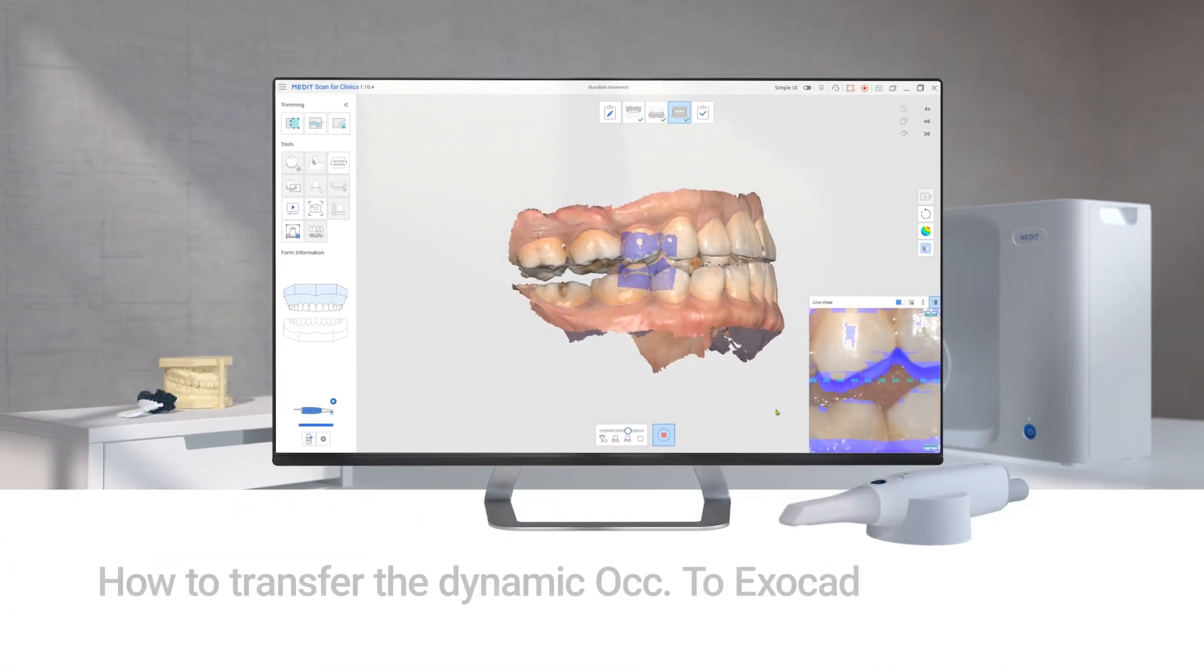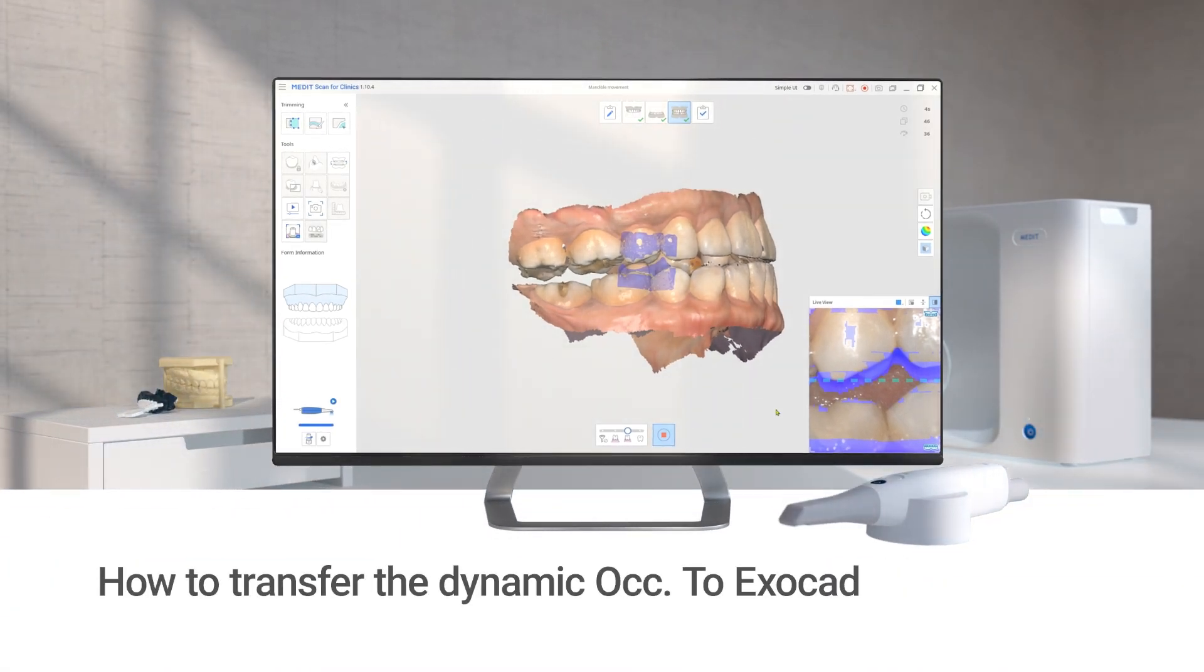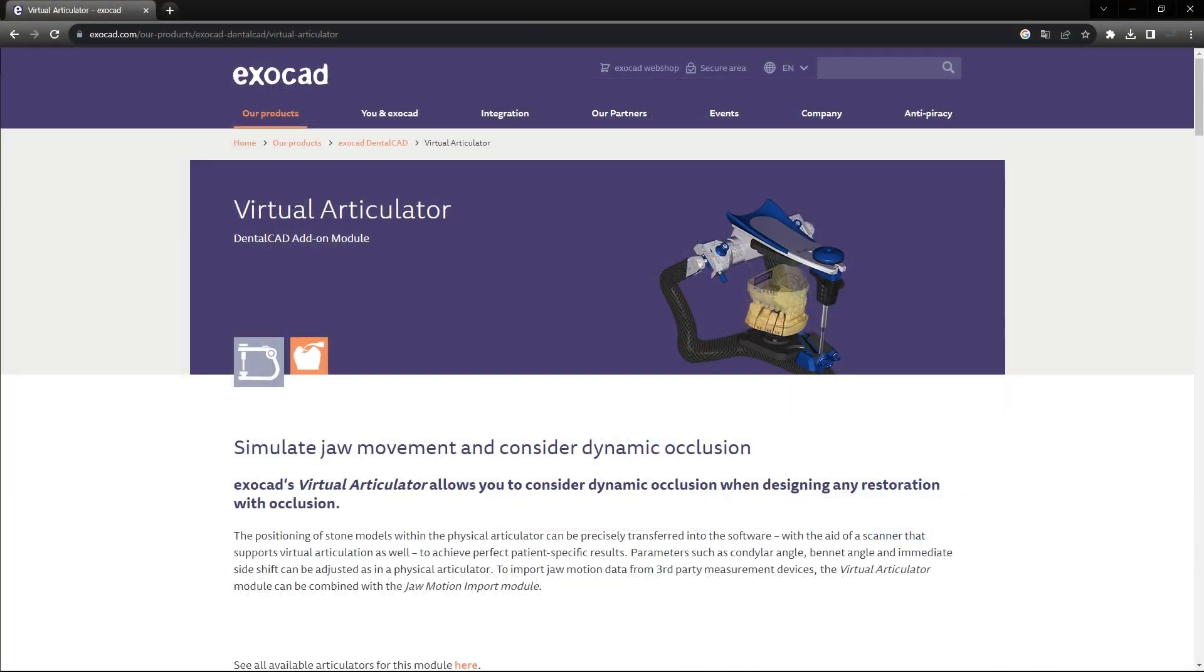This is a quick guide on how to transfer the dynamic occlusion to ExoCAD. Note, to generate and view the dynamic occlusion in ExoCAD, you need to have the Virtual Articulator Add-on Module.